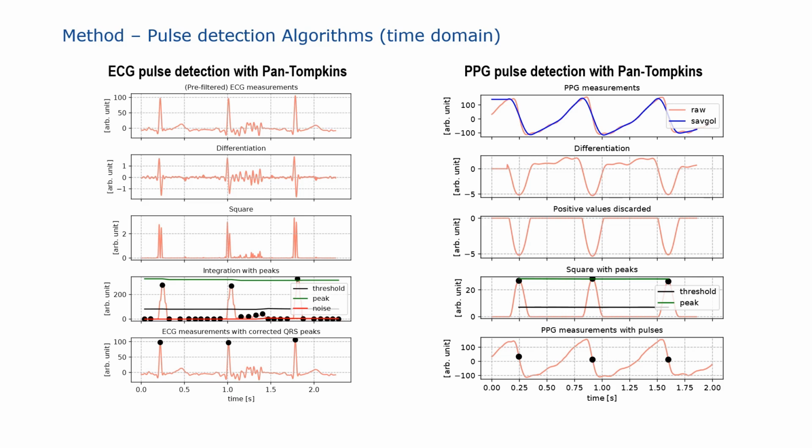A similar approach was used for PPG signals. Here we wanted to detect the steepest falling slope of the signal as it has shown to work best. First, the signal is filtered with a Savitzky-Golay filter to smoothen it and remove noise. After that, it is differentiated.